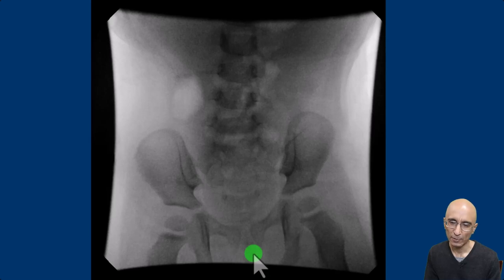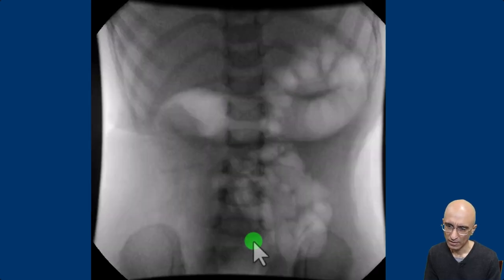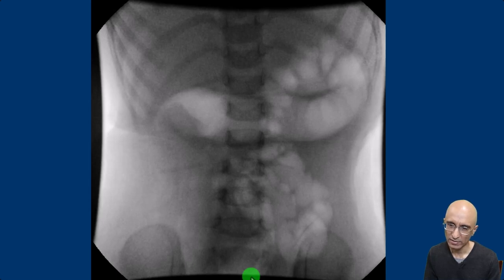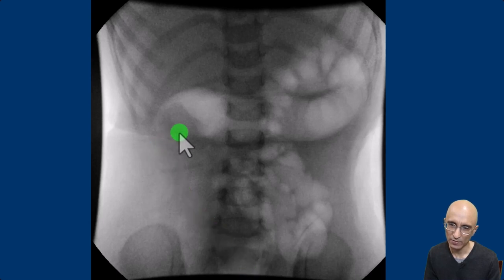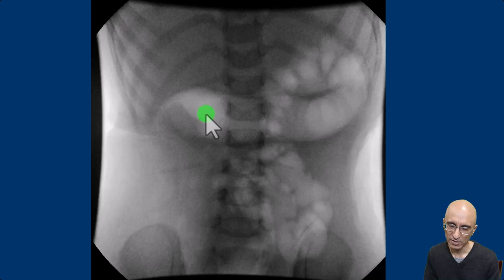We placed the catheter in the rectum and started insufflating air. You can see air within the rectum, sigmoid, splenic flexure, and transverse colon, and we can see the soft tissue density lesion with almost the appearance of a meniscus corresponding to the intussusception in the region of the hepatic flexure.